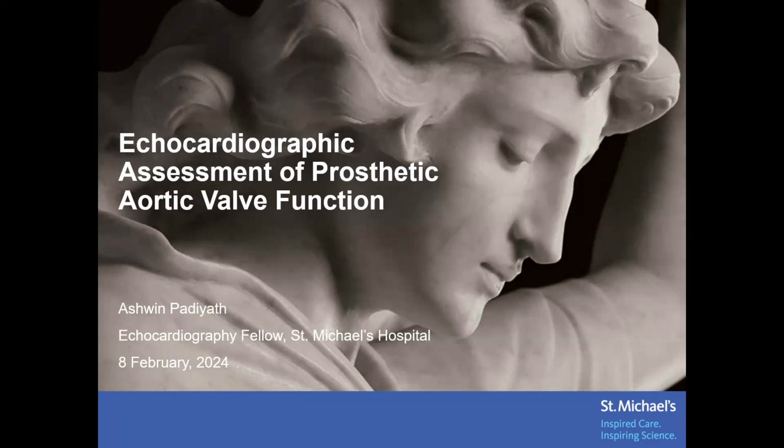So today, I'll just be talking about the echocardiographic assessment of prosthetic aortic valves. There's a new guideline that just came out earlier this year in January, the ASE. So that's what we'll be focusing on.